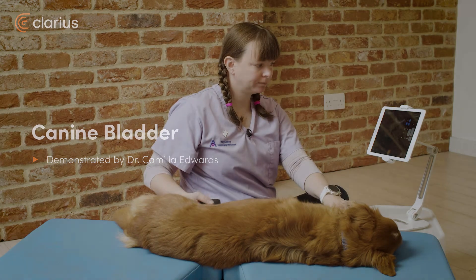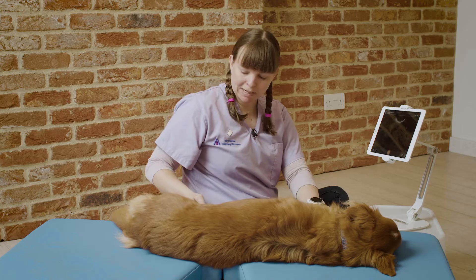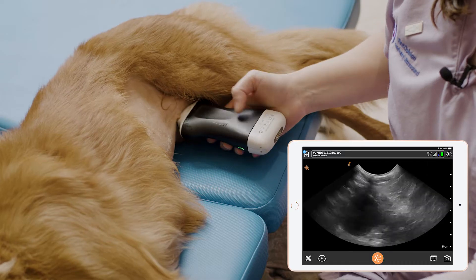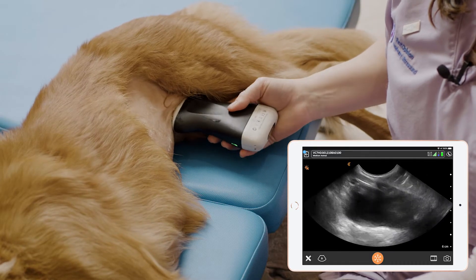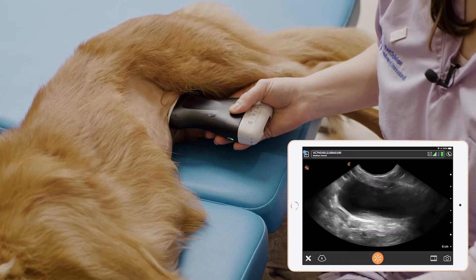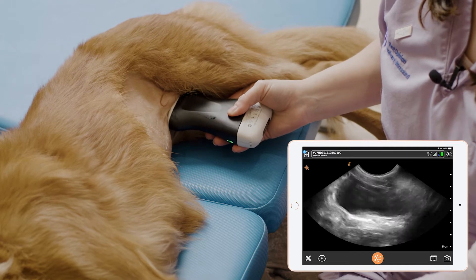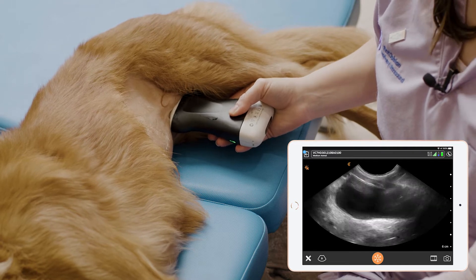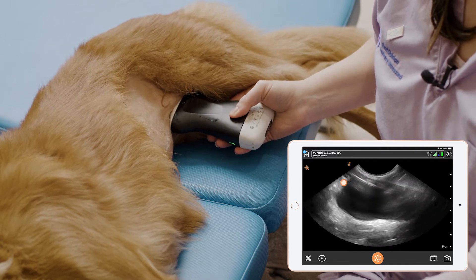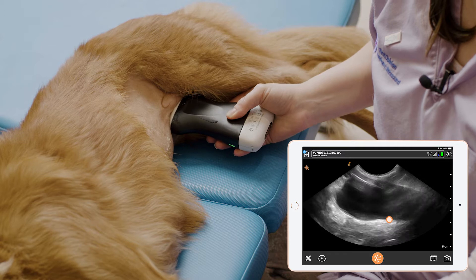Now we'll have a look at how to scan the bladder. We place the probe along the ventral midline pointing cranial to caudal in the caudal abdomen, and immediately we can see the bladder here.